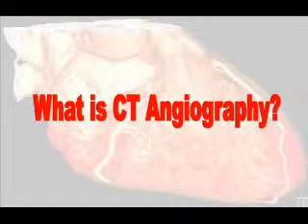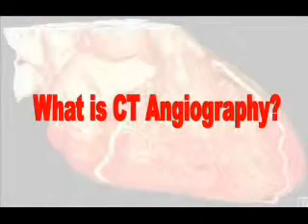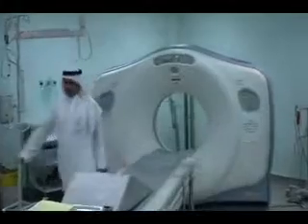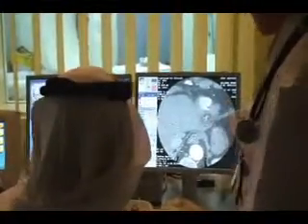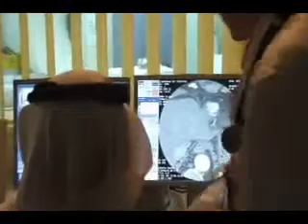What is computed tomography angiography? CT angiography is an exam that uses a special X-ray machine to view blood flow all over the body. CT takes pictures from different angles, which are then joined together to show detailed pictures of the vessel.